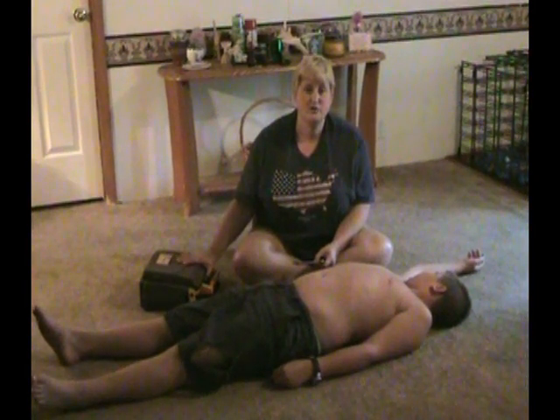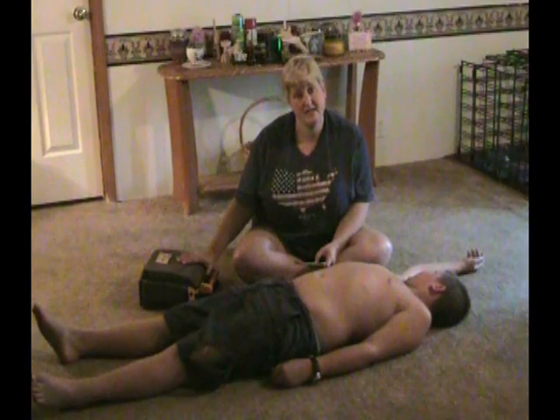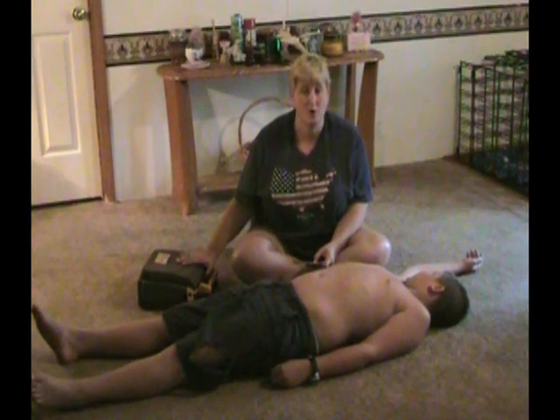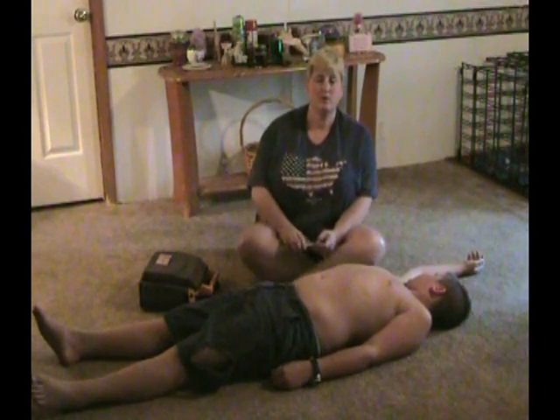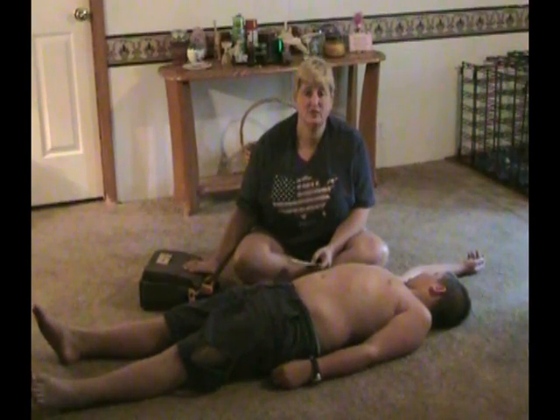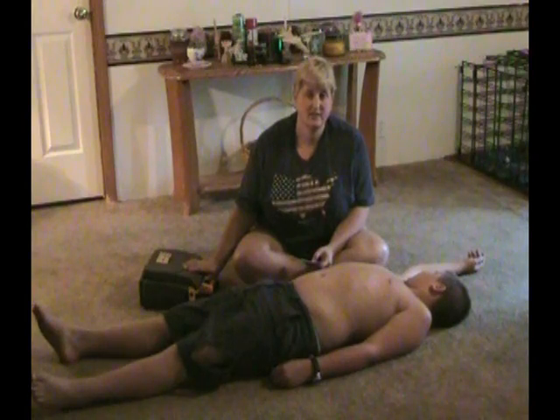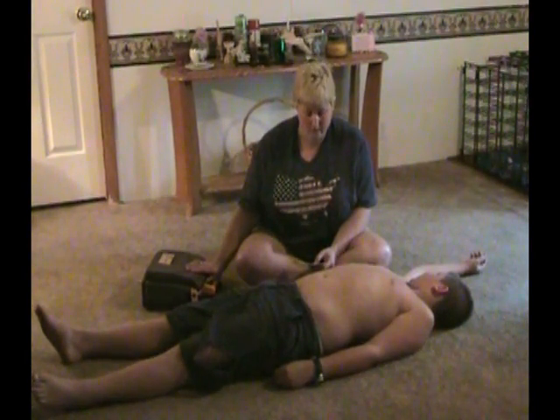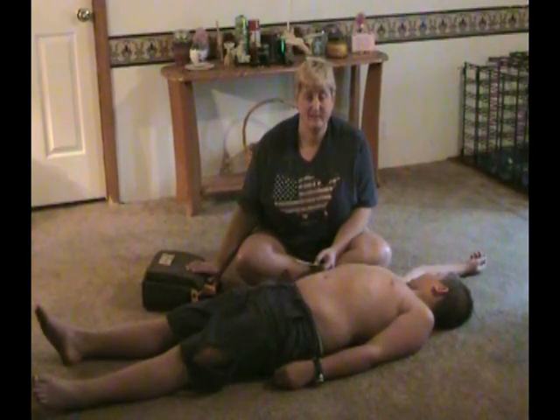It's easy to use, almost anyone can use it, and it improves the chance of survival by restoring the victim's heart pattern. AEDs are readily available in many places now: shopping centers, schools, daycares, recreation centers, grocery stores, airports, and many more. It's effective for 6 to 7 out of 10 victims.